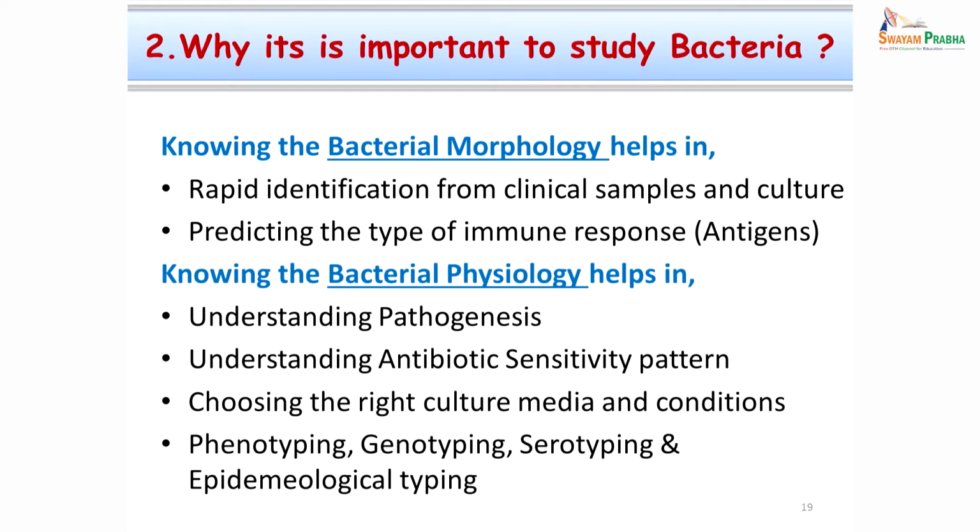Knowing the bacterial physiology, or the functions of bacteria, is rather crucial. It will help us to understand their pathogenesis, which will help in prevention of the diseases. Understanding their antibiotic sensitivity pattern is possible. Choosing the right culture media and the conditions we provide, especially for aerobic and anaerobic organisms, is important.